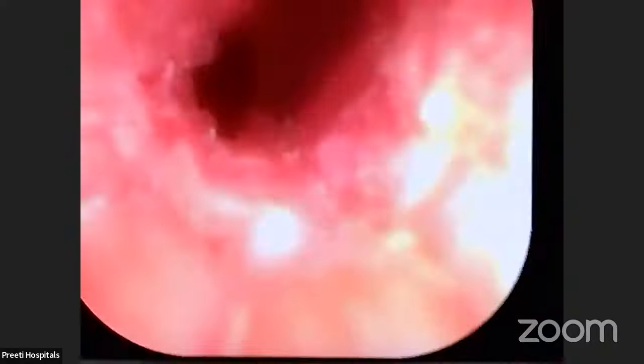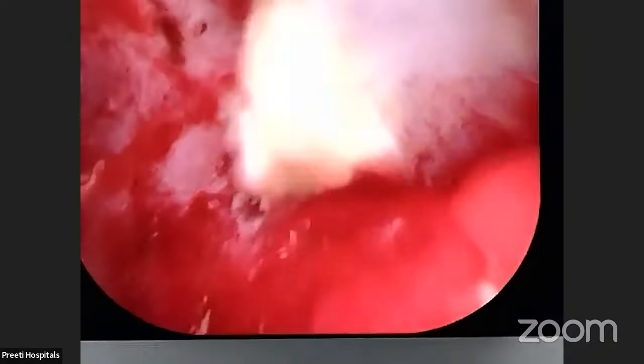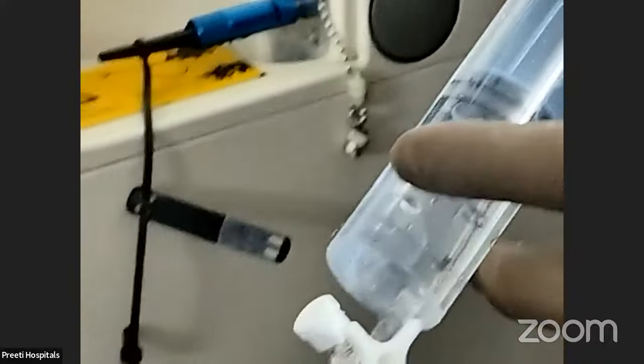See, the entire calyx is empty. And at the end, zero stones. We do CT tomorrow. We can wait. Yes, flush. Yes. I agree. There are 2-3 points. One is the ureter. Second is the pressure. You keep it. But if you constantly suck, there is no problem.